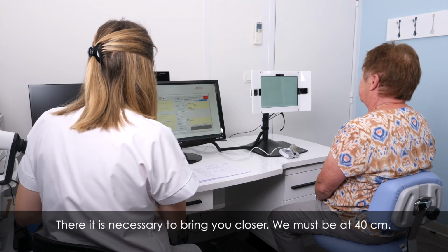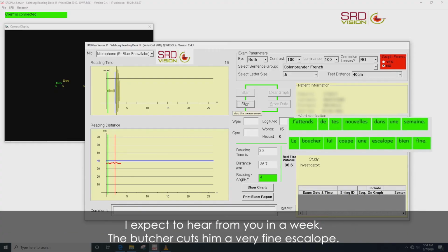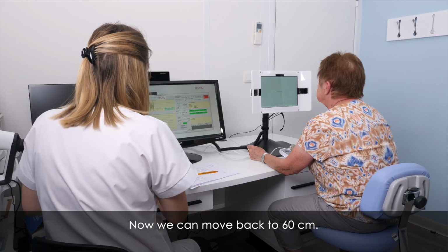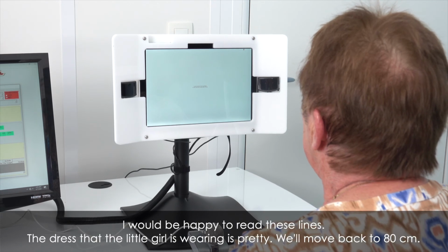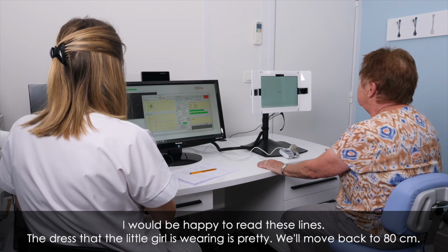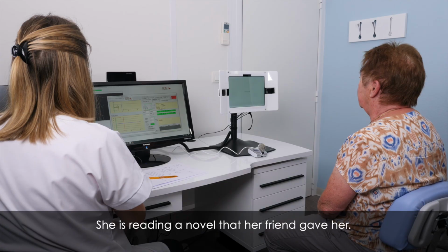There, it is necessary to bring you closer. We must be at 40 centimeters. I expect to hear from you in a week. The butcher cuts him a very fine escalope. Now we can move back to 60 centimeters. I would be happy to read these lines. The dress that the little girl is wearing is pretty. We'll move back to 80 centimeters. She's reading a novel that her friend gave her.